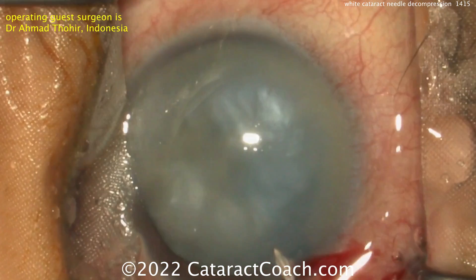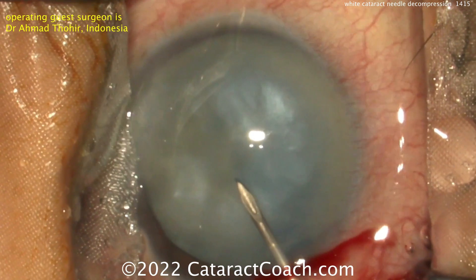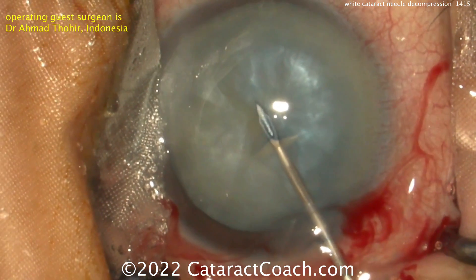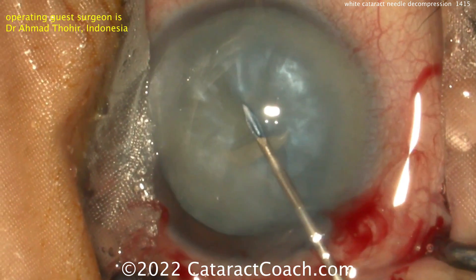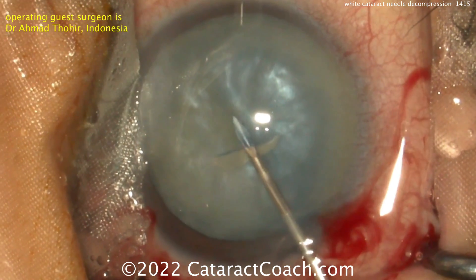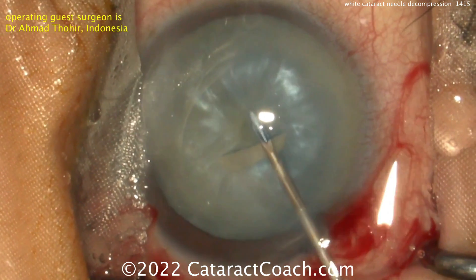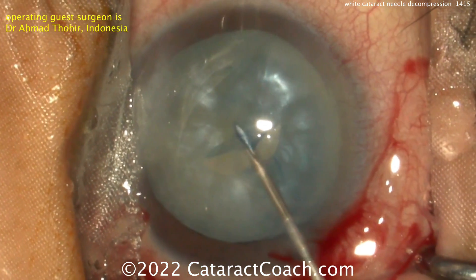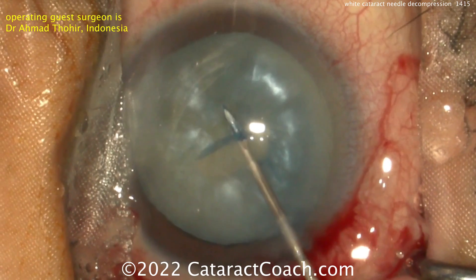So we're going to do a needle decompression, going in with a needle on an empty syringe. You can aspirate out some of the liquefied lens material and thereby decompress the capsular bag — remove that pressure gradient. I like to go bevel down because I think I'm more likely to aspirate some of that lens material and less likely to aspirate the anterior lens capsule.